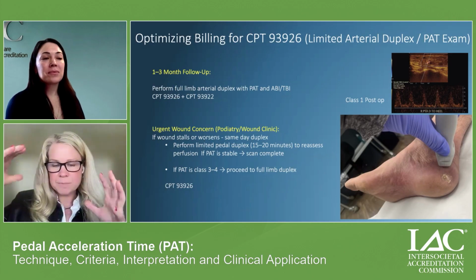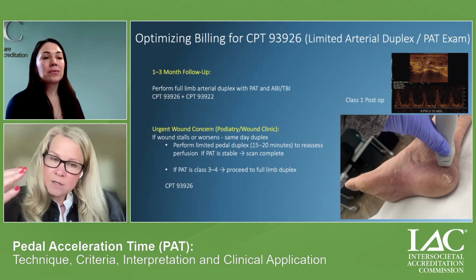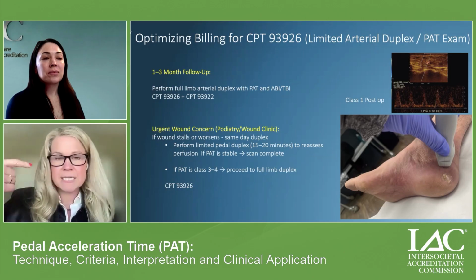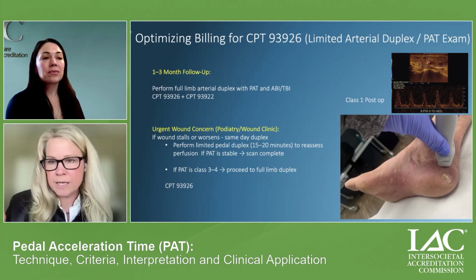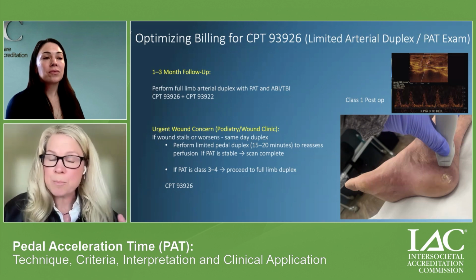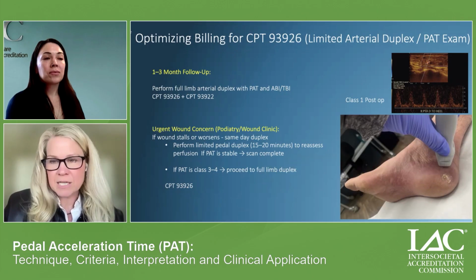So think about two different beds. We have the arterial PAT that we still have to assess after a DVA, but now we have the pedal venous anatomy that we also evaluate. Yes, we want to know patency and flow volume, but we're also looking for pedal venous maturation in that new neovascular bed. And that's where we will measure the venous pedal acceleration time.